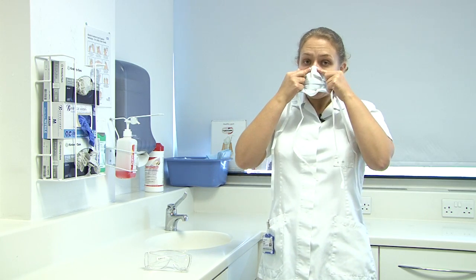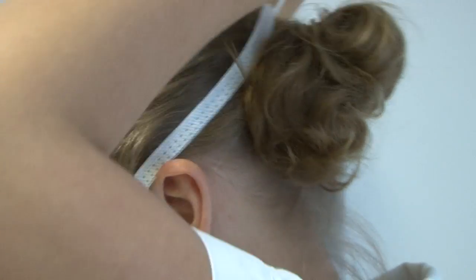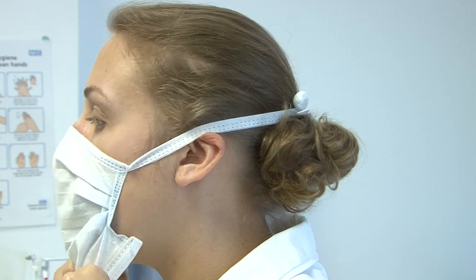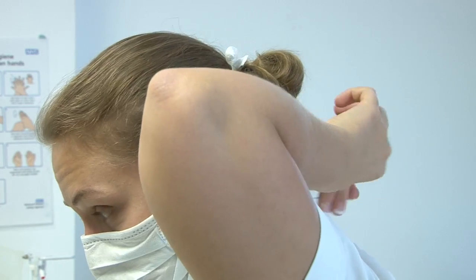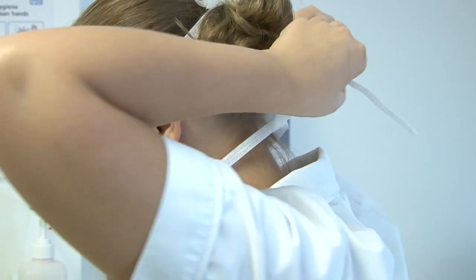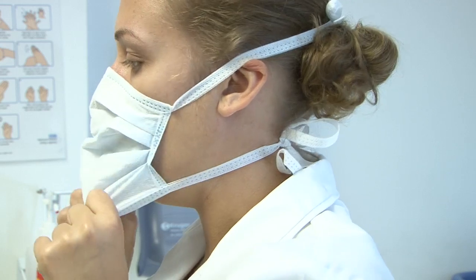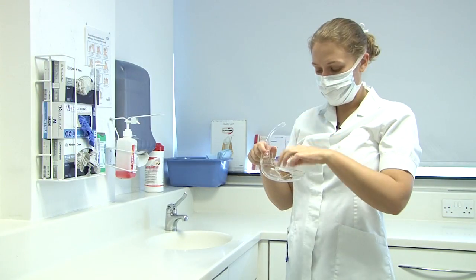So on goes your mask. You tie it in a bow at the back. Pull it round and make sure you've got a nice gap at the bottom. This should stop your glasses from steaming up, and tie it in a bow at the back of your neck. Just make sure you've got a nice bit of room so you do not steam up. Next you place your glasses on.